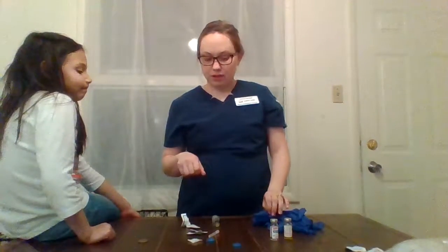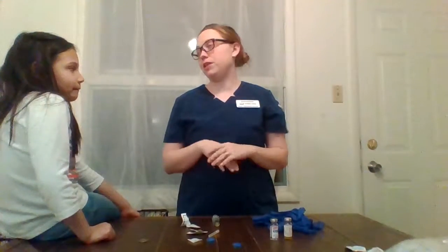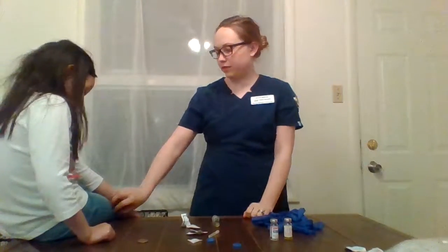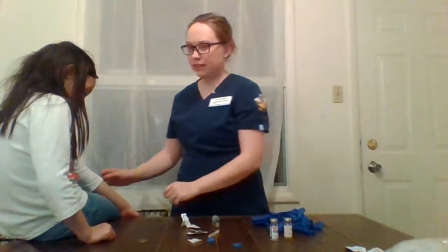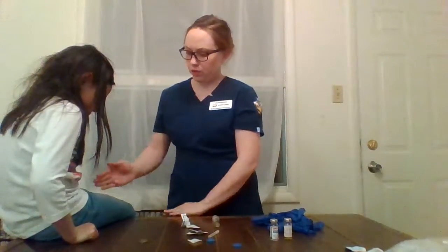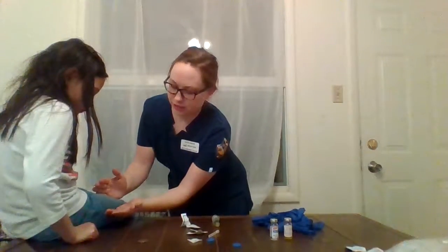I'm going to perform hand hygiene. I'm explaining to the patient what I'm going to do. I'm going to be giving you an IM injection in your vastus lateralis, which is the lateral side of your thigh muscle here. To find it, turn just a little bit. You go the midline, the top of the thigh, the side of the thigh, and you're going to be giving it to this area.